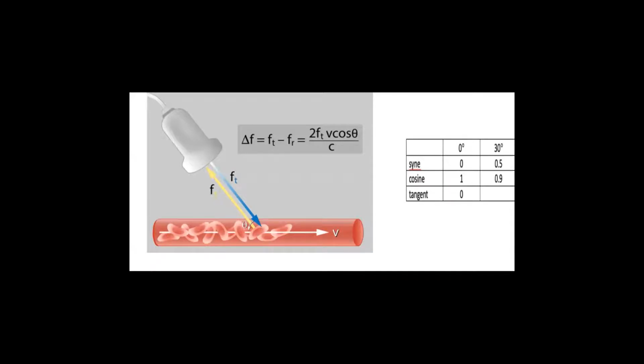Yeah. I need to optimize the image. For example, if I want to interrogate the aortic valve, I need to put it in the middle and make the beam parallel to the flow. Okay, good. And this is also for the other valves or the area that I want to interrogate. So optimizing the image quality is one way, yeah.